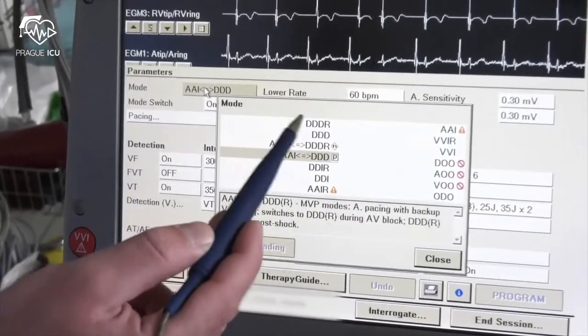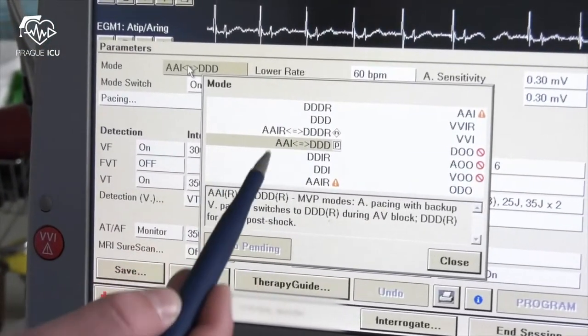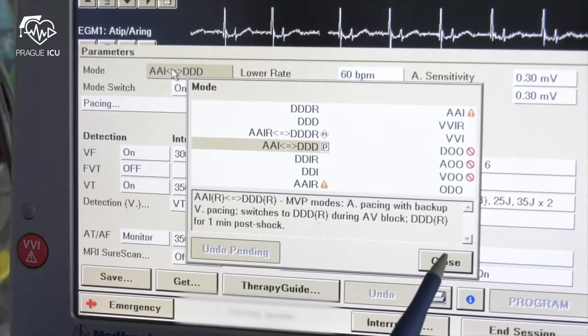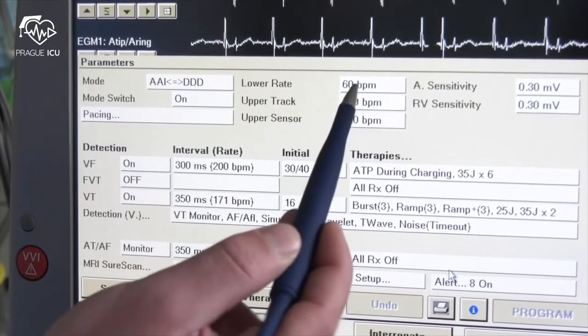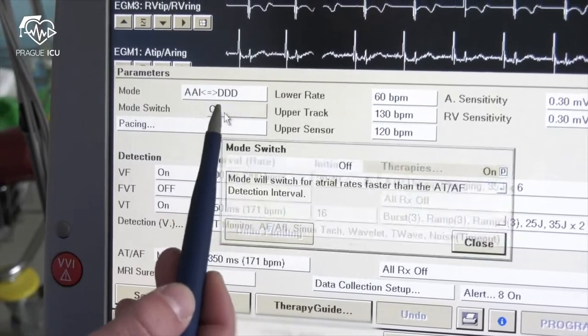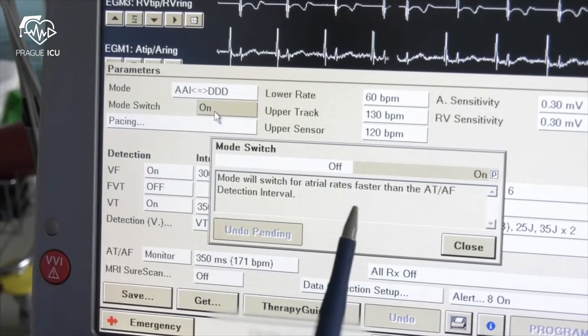In the mode section you can choose between different operating modes. This device is set to AAI DDD, which is preferable for atrial pacing with backup ventricle pacing if needed. Mode switch function is nominally switched on. Mode switch is a rate control feature designed to prevent the tracking of paroxysmal atrial tachycardias. This is performed by placing the device in DDIR mode until the episode is over, preventing a rapid ventricle pacing rate in response to a rapid atrial rate.